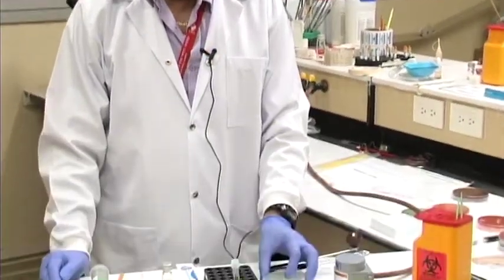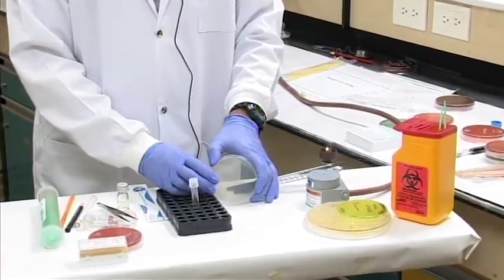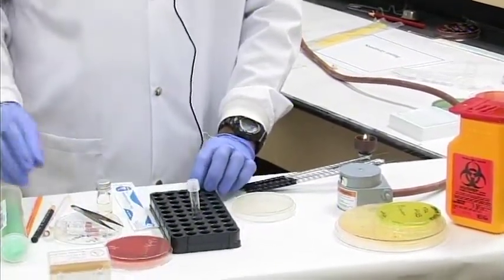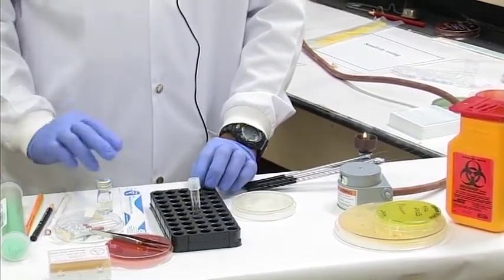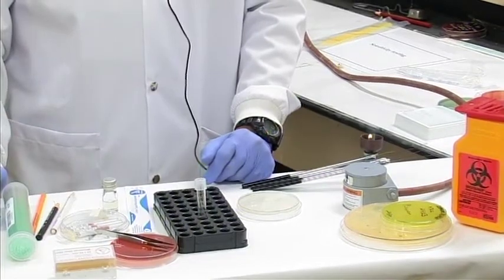So to perform a sensitivity testing, we will need an agar plate called a Mueller-Hinton plate. This Mueller-Hinton plate is a specialized agar used for AST testing or sensitivity testing. We'll need your pathogen, which will be on an agar plate. You'll need your antibiotic disc, which we have, a swab for inoculation, and we will now move on to how we actually perform the AST testing.